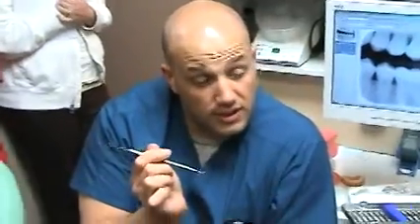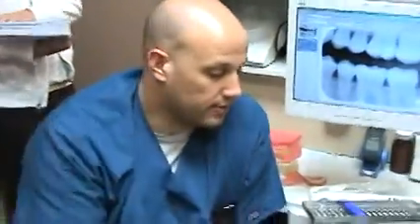Okay, so I use an instrument like this, and the cavity is soft, so I can scoop it out. When I've got all the cavity removed, it's hard, and it becomes very hard for me to do this. So if you feel the dentist in there scooping with something, that's what he's doing. He's in close and he wants to get all the cavity out prior to placing the restoration. Okay, so that's what that is.